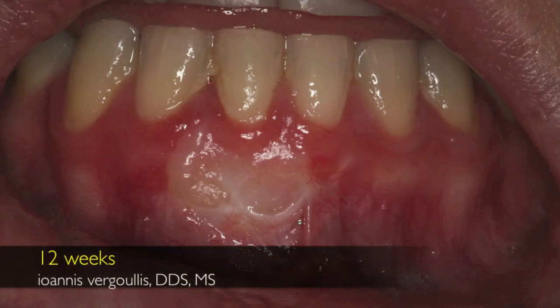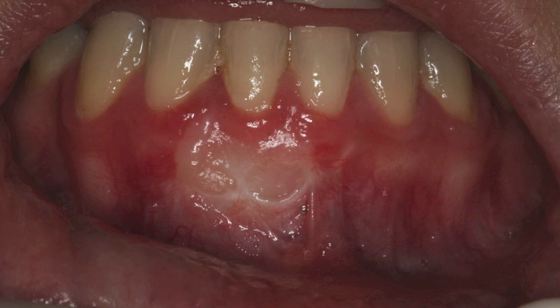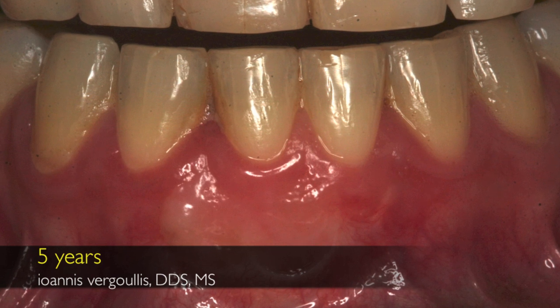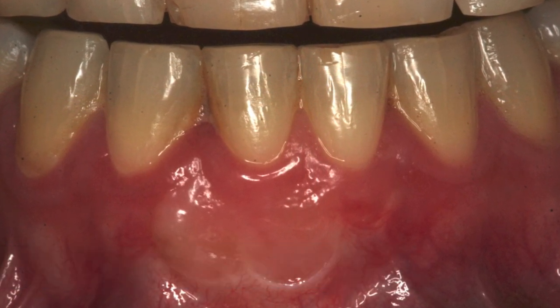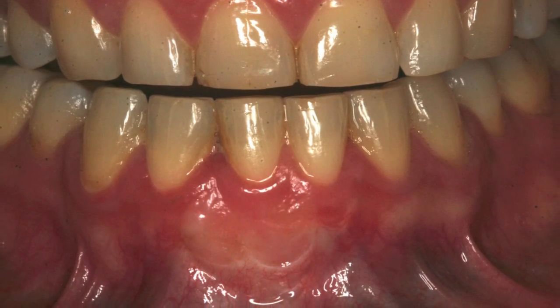Being more patient, twelve weeks later we can see that with creeping attachment the recession has been completely covered. Five years later we can see that we were able to achieve a very good and stable result by using the technique of free gingival graft to cover the recession on the lower incisor area. Thank you.